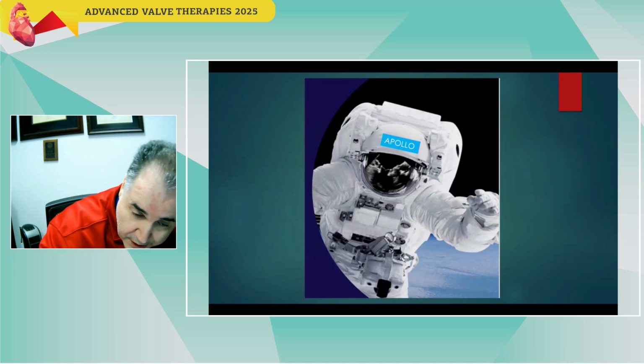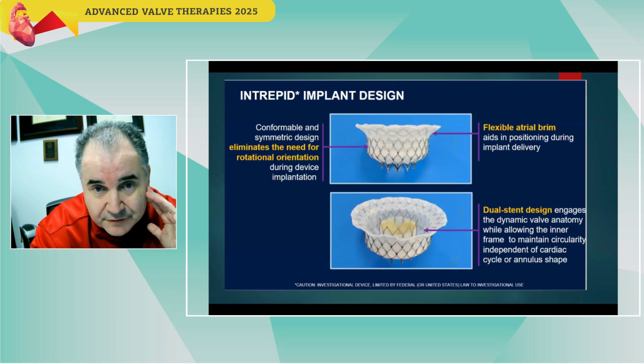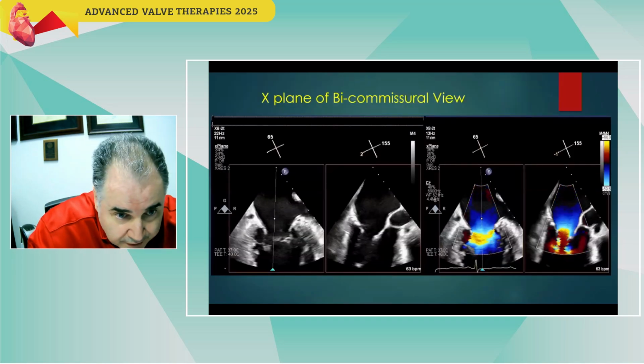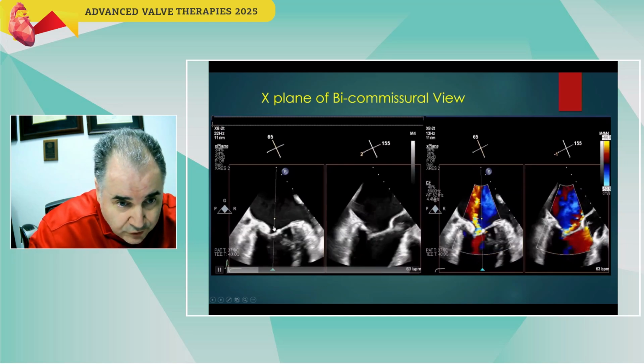We are here part of the Apollo trial, and I love this image. There are two or three transseptal valves of this type at this time, and this is again transseptal therapy. Again, as I told you, the bicommissural view.